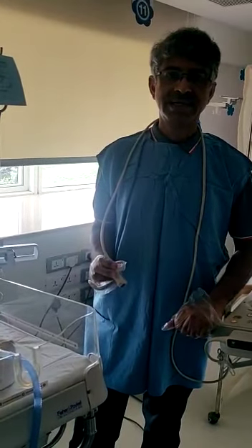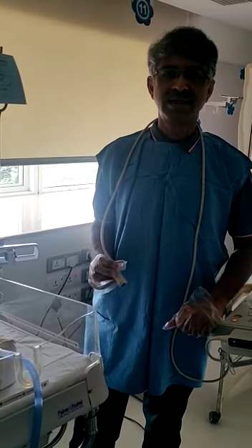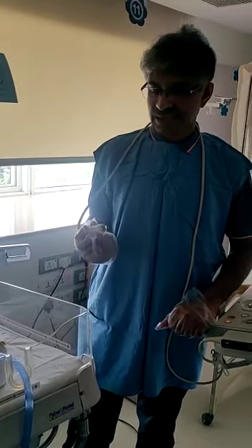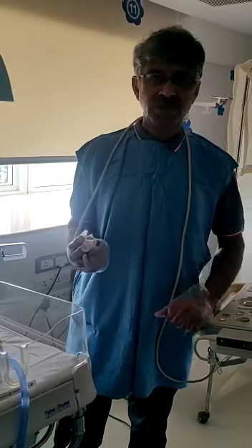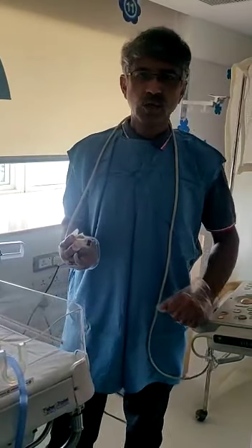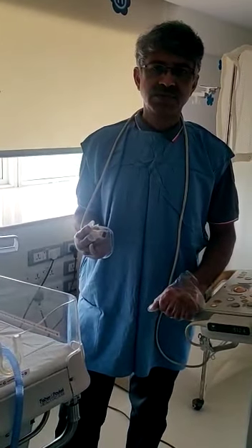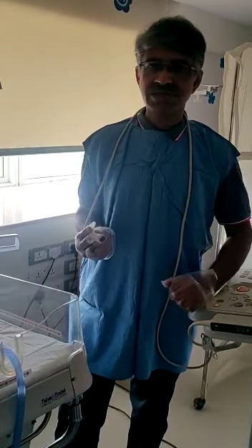Hi, I am Dr. Venkatesh. I am a consultant and dermatologist. Today I am demonstrating echo evidences of transposition of great vessels.